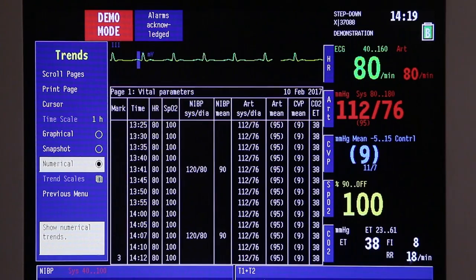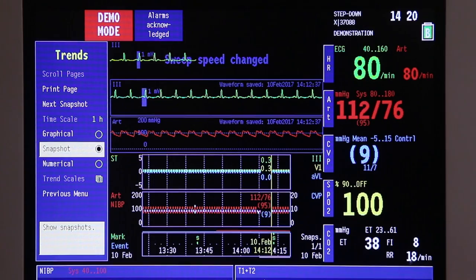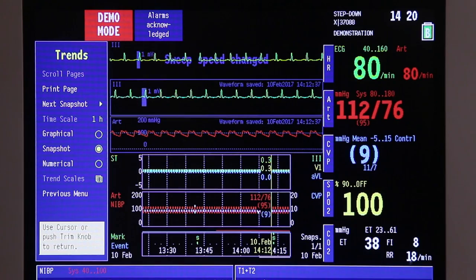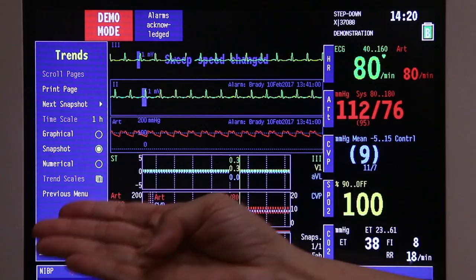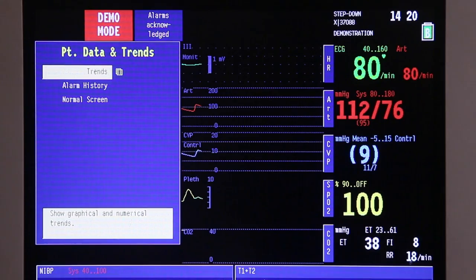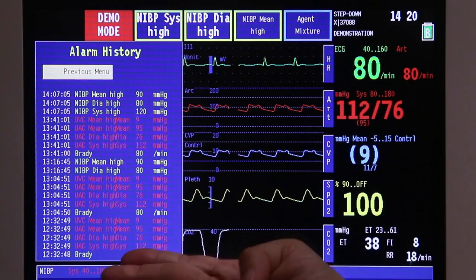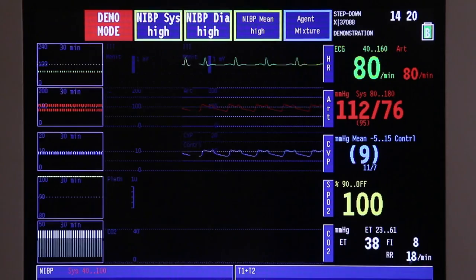Numerical trends contain 4 pages with a maximum of 72 hours of trend data. Lastly, the snapshot is on this page — click the trim knob to choose the next snapshot, then rotate to scroll through the snapshots. Once done, go back to the previous menu where you can see the alarm history. Press the trim knob and you will see all the alarms that happened to your patient. Press the trim knob once again to return to the previous menu, then go back to the normal screen.